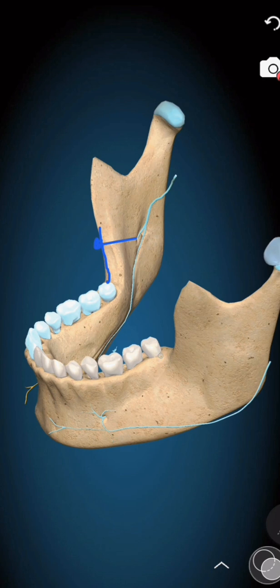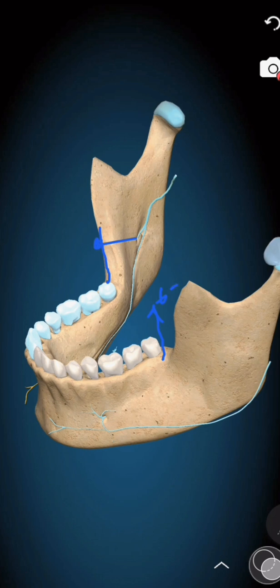Steps of the procedure — patient positioning: place the patient in a semi-reclined position with the mouth wide open. Determining the point of needle insertion: approximately six to ten millimeters above the occlusal plane of the mandibular molars.